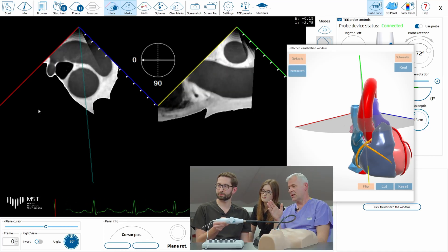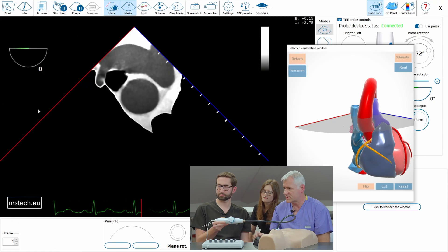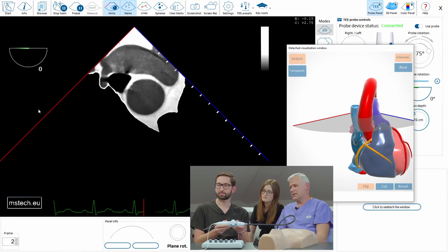Let's show the aorta in two views simultaneously so both images are ready. Now we switch off the X-plane so it doesn't disturb us, and let's go slightly deeper.